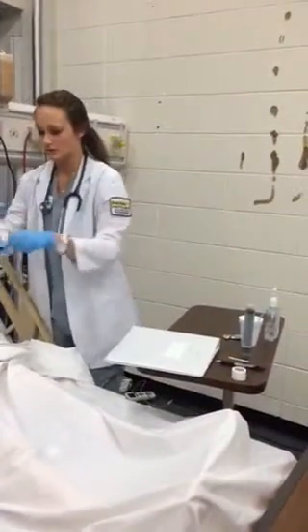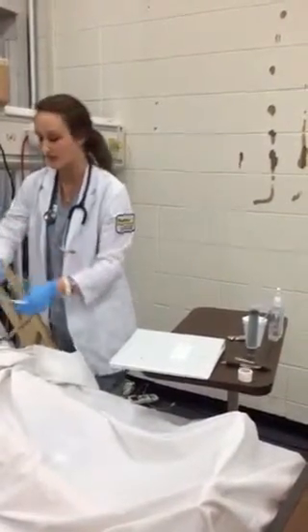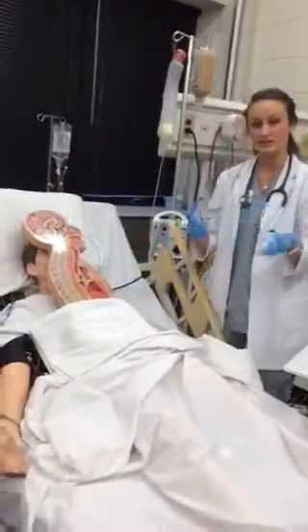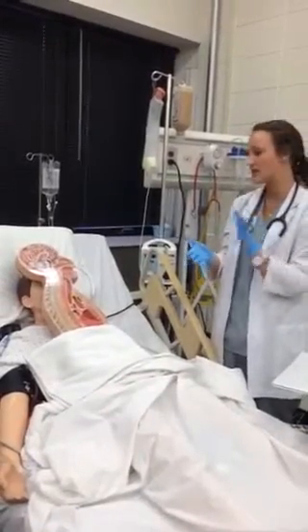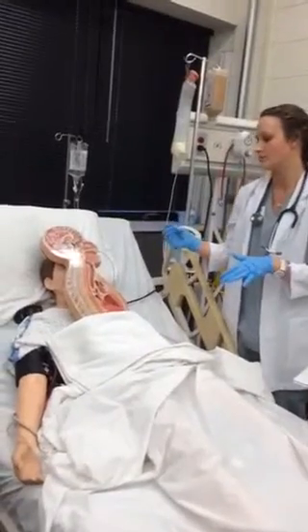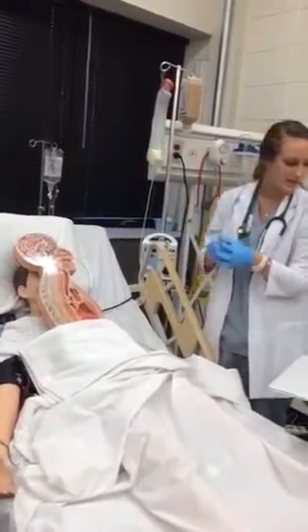All right. So I have clamped my tube after I removed my syringe, and it's capped on. Then you would secure it to the gown or to their face behind their ear, somewhere where it's not going to move and pull out on accident. And whenever you're done with that, you're going to do the oral hygiene. Oral hygiene and probably your nose as well, just so that everything's clean.